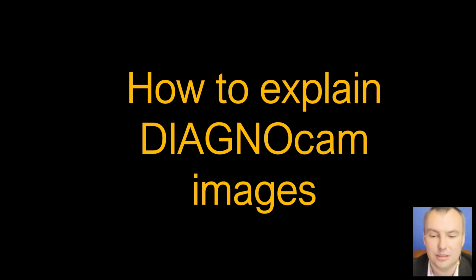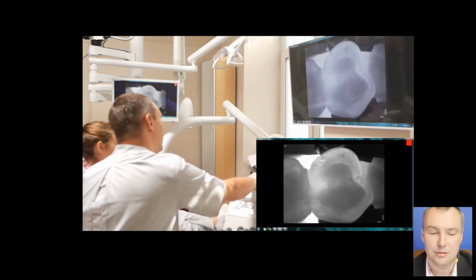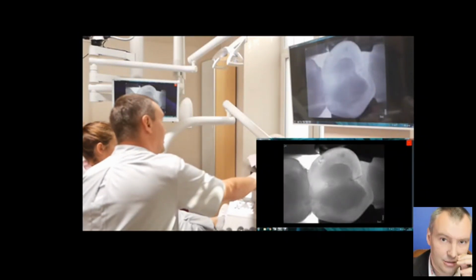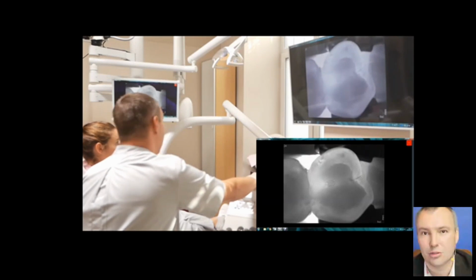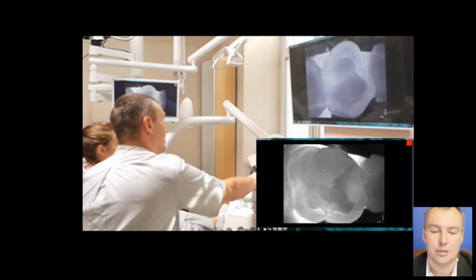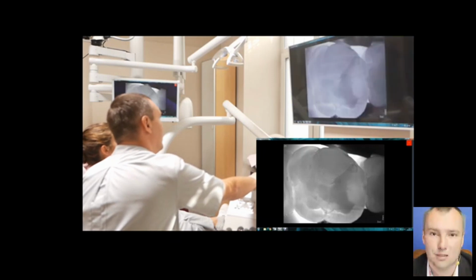How to explain a DiagnoCam image? The adult patient is seated and together we go through the image where I explain what is light, where is the enamel, where is dentin, where is caries, what are all the changes. I allow my patients to ask, what is this, what is this? This is how it works for me when we look through the images together with a patient. As you can see, it works quite well. Also, the patient can see everything.